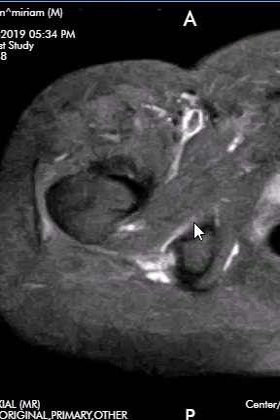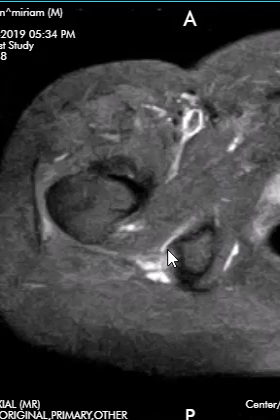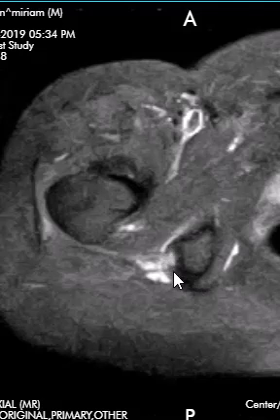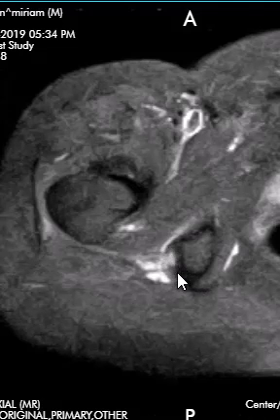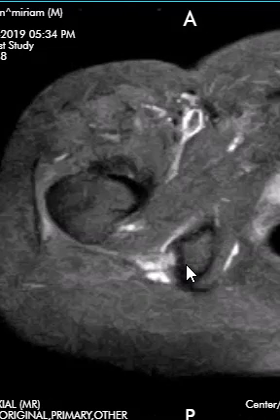So here we go. This is the ischial tuberosity, and we see the hamstring tendons. They attach out here laterally and posteriorly. The posterior attachment looks fine - it's just this lateral component that is torn. You see fluid at the site of tear, and this is the semimembranosus.